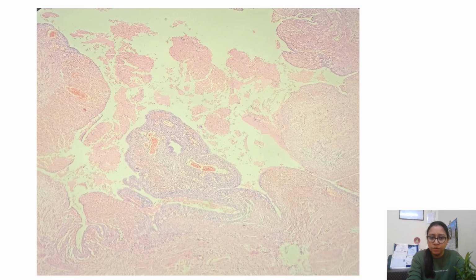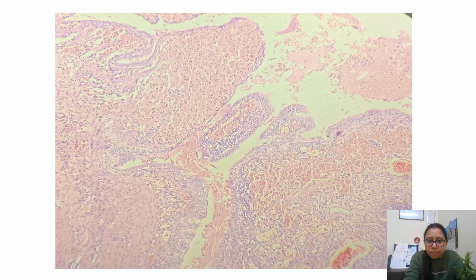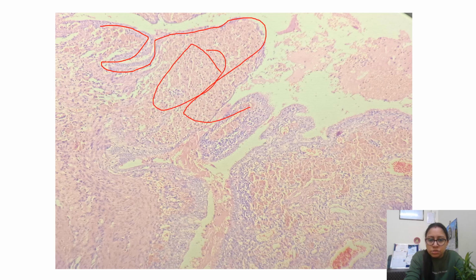See, this is the fallopian tube structure. The plica, you can see, the fallopian tube structures coming inwards. In this low power, these are histiocytes. I'll show you the high power. See, this is the single cuboidal to columnar lined epithelial surface, and what is in between are the sheets of histiocytes.